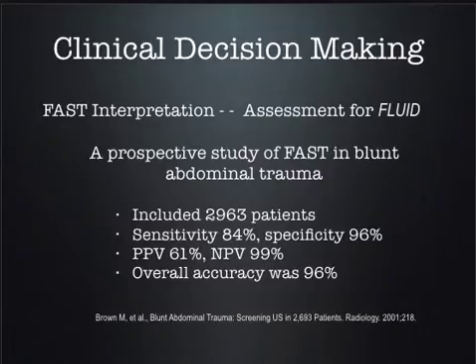So how good is the FAST exam for picking up free fluid? This is an older study from 2001. It used almost 3,000 patients. How good? 84% sensitive in picking up free fluid. That's pretty good for a medical test, to be honest with you. It's actually probably a little bit better than that. But the FAST does miss injuries.